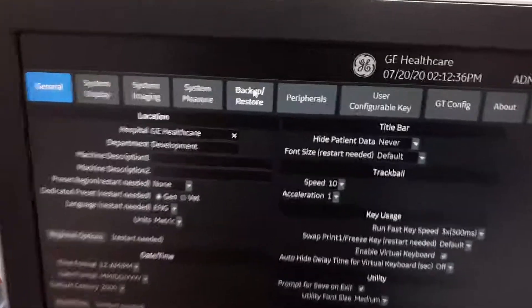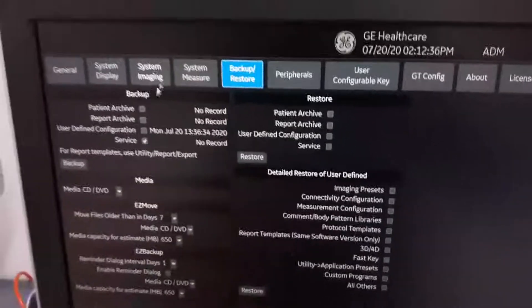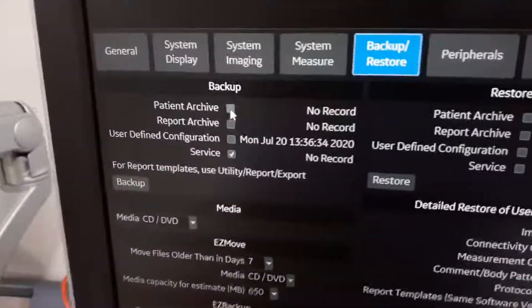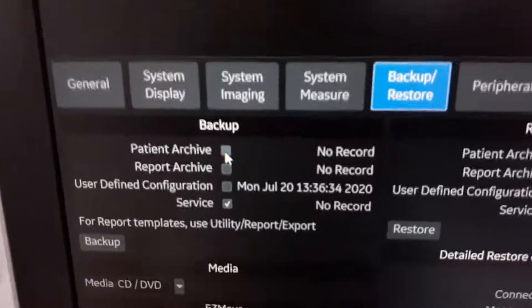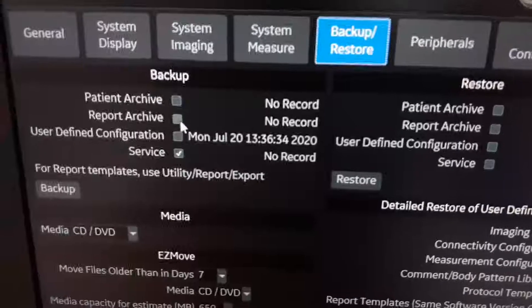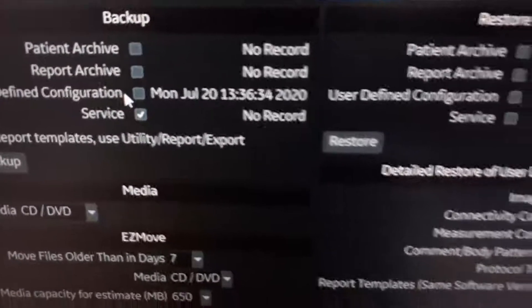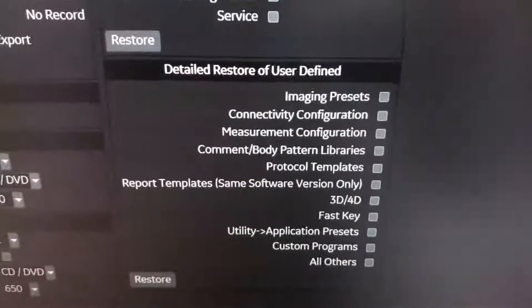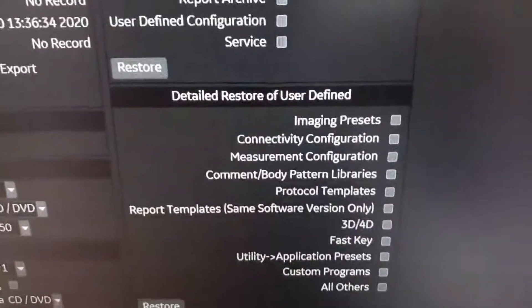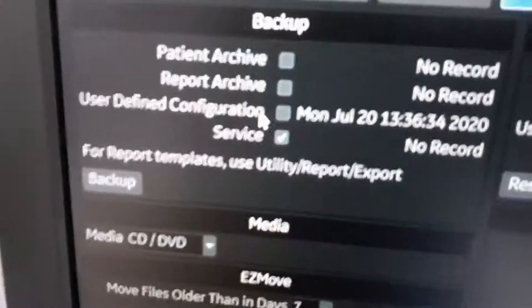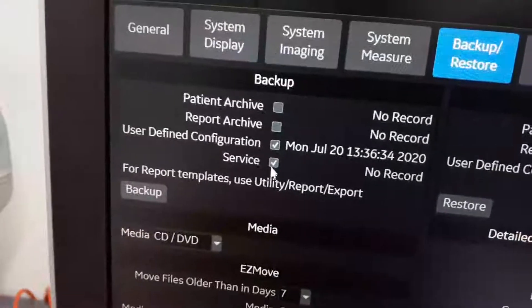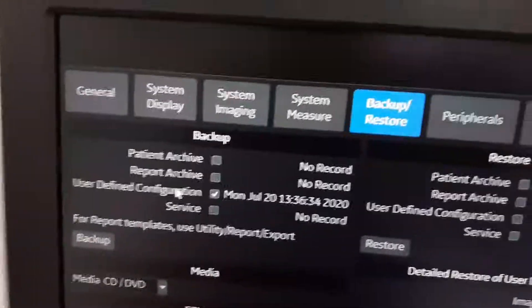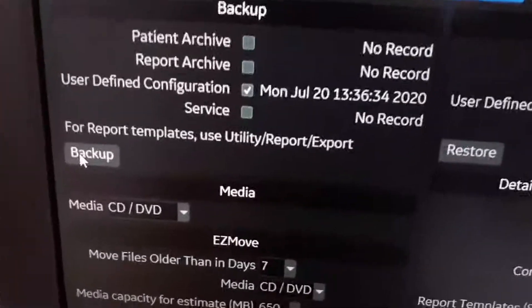In Backup and Restore, choose what you want to back up: patient archive without photos, report archive, and user-defined configuration — which includes imaging presets, connectivity configuration, measurement configuration, etc. We need user-defined configuration, so check it. Uncheck the service option, as we don't need it.